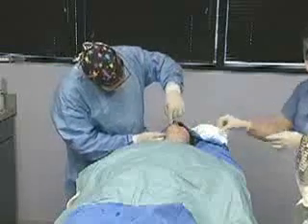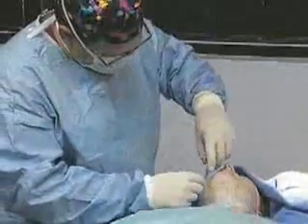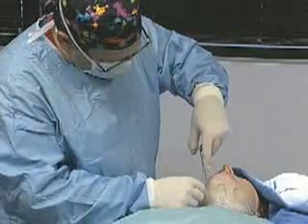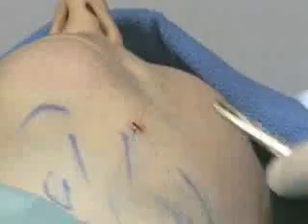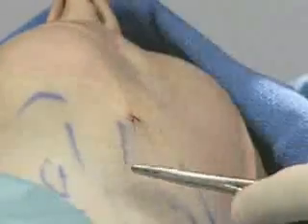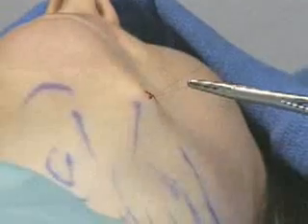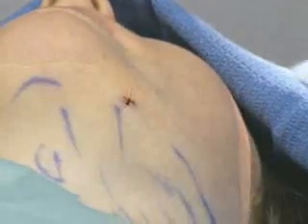Looks great. We put one little stitch on each side that we had before. Take them out about 5 days. Mm-hmm. That way we can look at you too and make sure everything looks okay. All right. And that's the whole procedure.